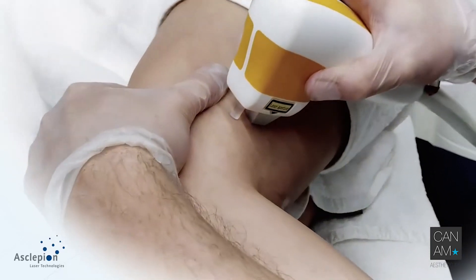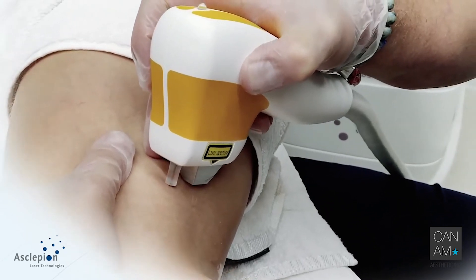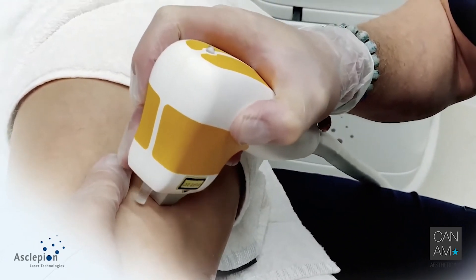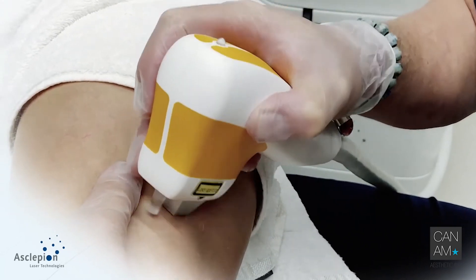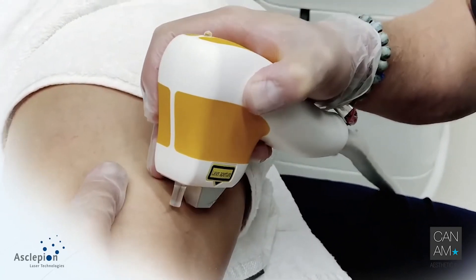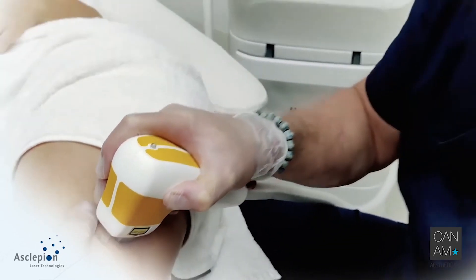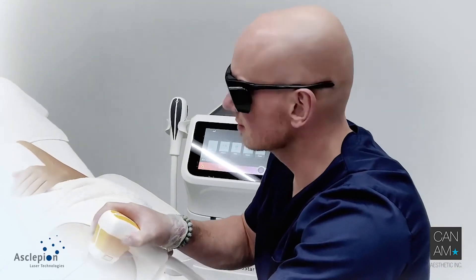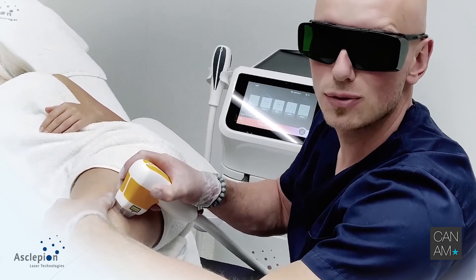Pre-cooling, always maintaining good contact with the patient. Here we go. Three, two, one. And two more. Three, two, one. And three, two, one. Good contact, good cooling — this maintains a literally pain-free treatment.